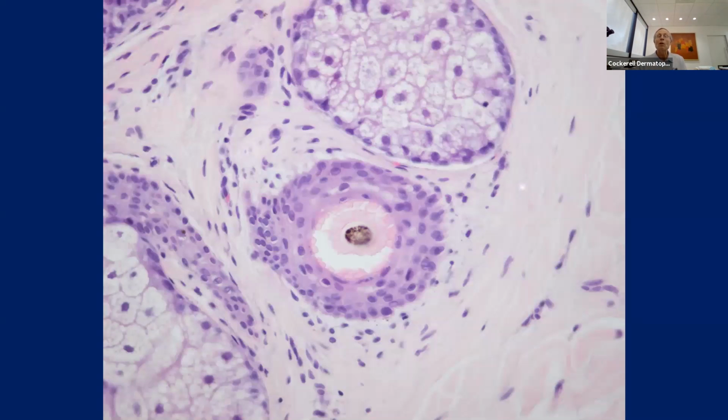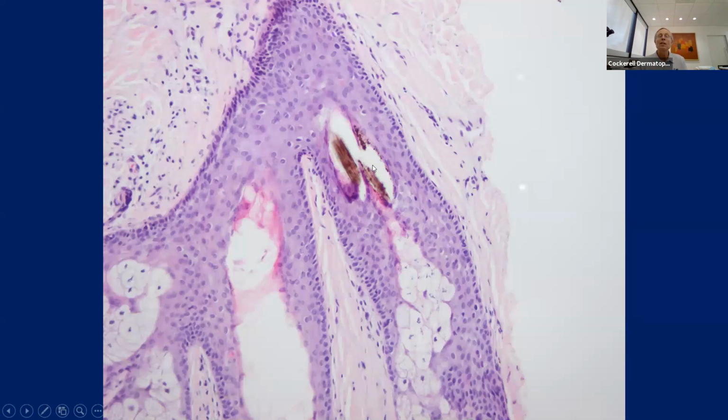However, if you start looking at the individual follicles, there's a fracture of the internal root sheath here. And then there's also this hair shaft that's disrupted and fractured here. So there is some pattern alopecia, you're right, but yes, good, I'm glad you picked up on that, there's also a manifestation of trichotillomania in this slide. So this is a two for the price of one. Get your money's worth here.